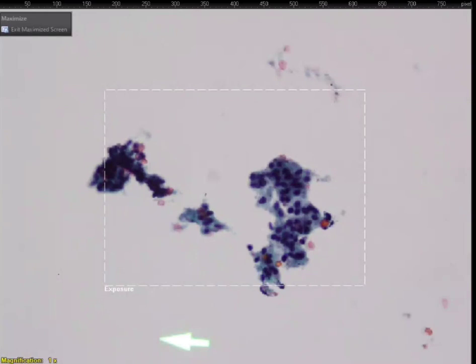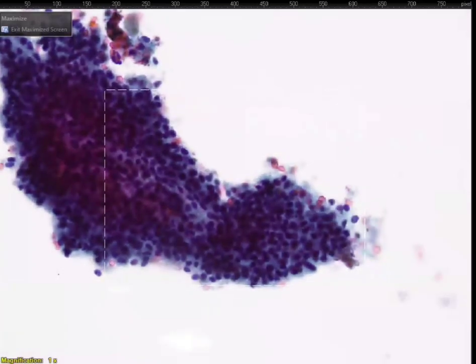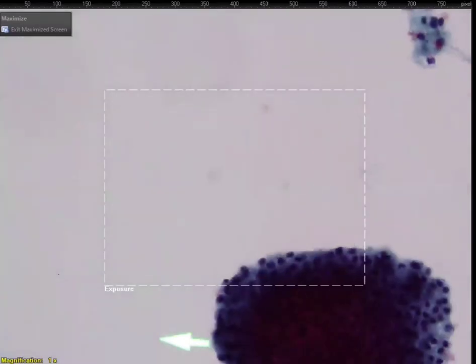Metastatic papillary neoplasm, maybe. Interesting. So yes, it does look quite papillary, doesn't it? Especially that other group we looked at, and this one here, especially the tip of a papillae. See that? Smooth edge everywhere except where it got broken off. Tip of a papillae, right? Everybody appreciate that?